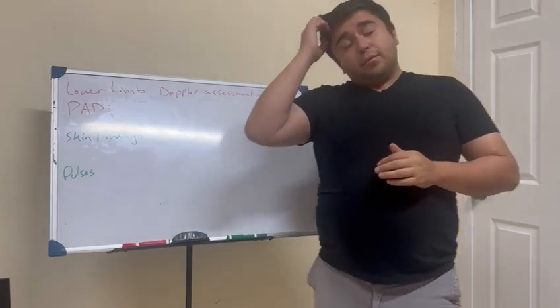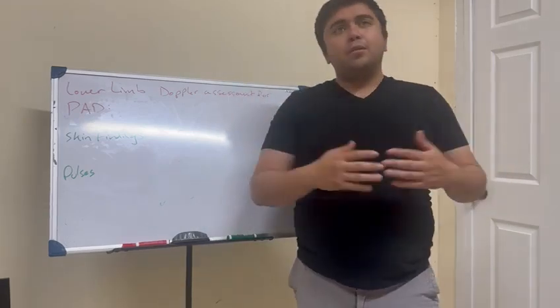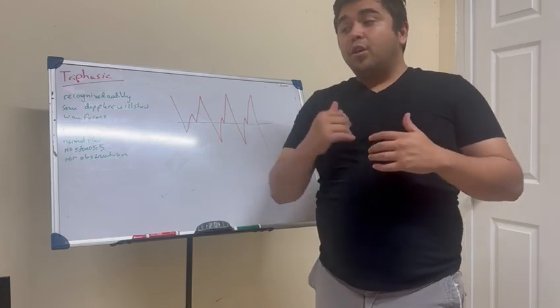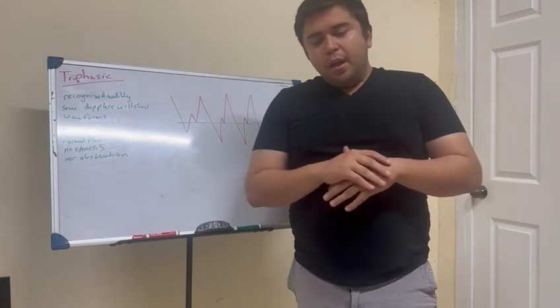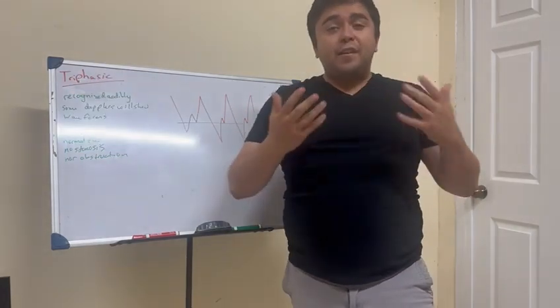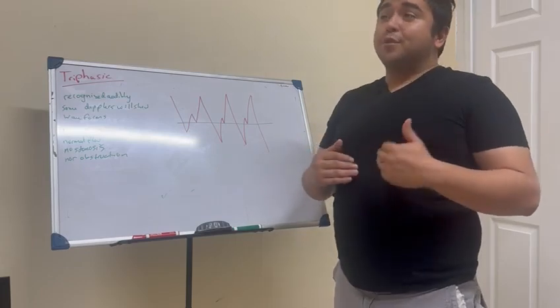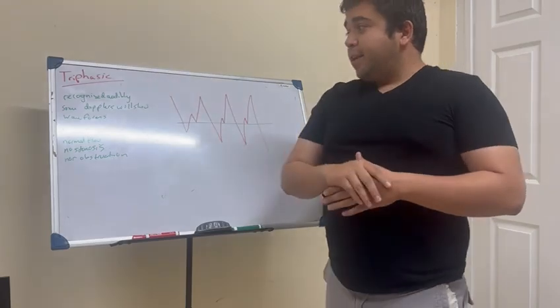And now I'm going to start touching on the Doppler sounds. One of the sounds that you're going to hear when you're assessing arteries using a Doppler, specifically without a monitor, is a triphasic sound. And a triphasic sound is exactly what you would think. You're going to hear three different sounds, and you'll recognize it audibly.